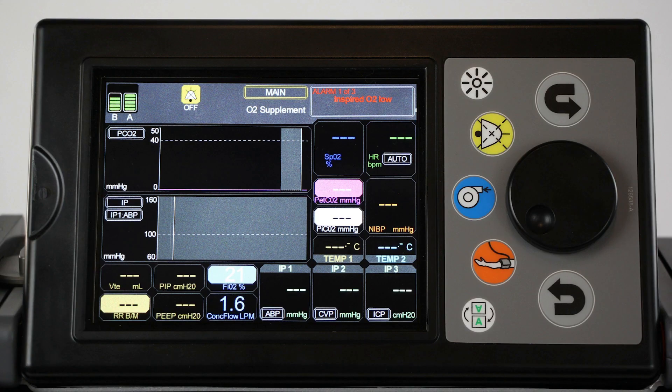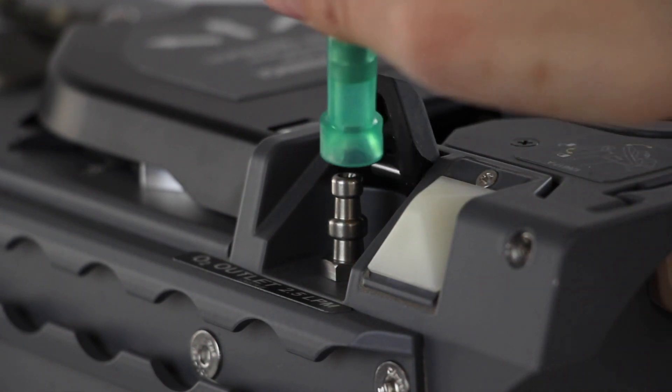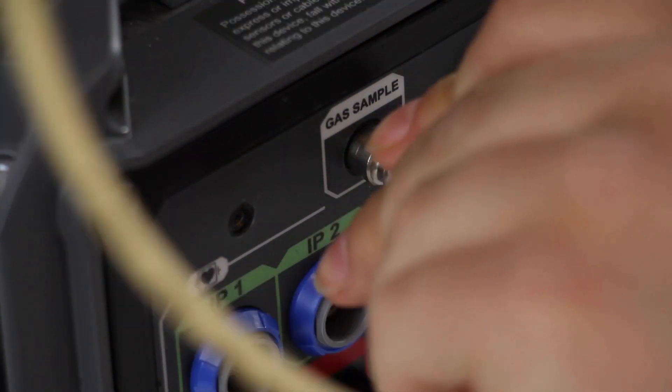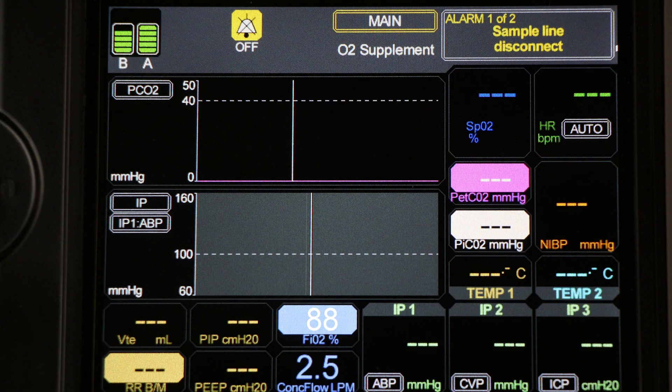Allow the system to run in O2 Supplement mode for at least two hours. While the device is still running, connect the O2 Outlet Sampling Adapter to the O2 Outlet, then connect the attached tube to the gas sample port on the Patient Connections panel. Navigate to the main screen and ensure that the output concentration reaches a minimum of 88% in O2 Supplement mode, otherwise the ATF module may require replacing.